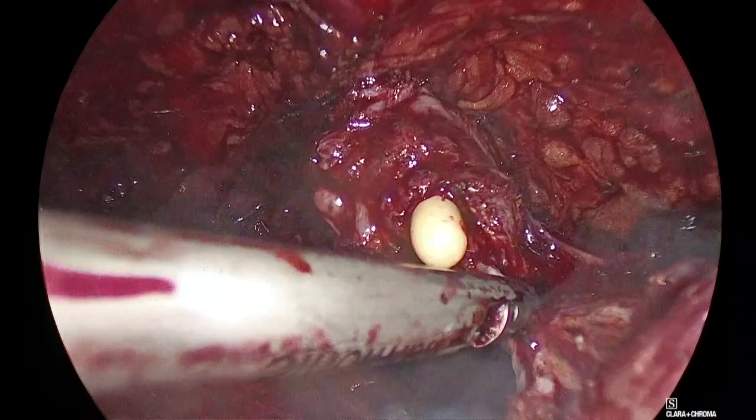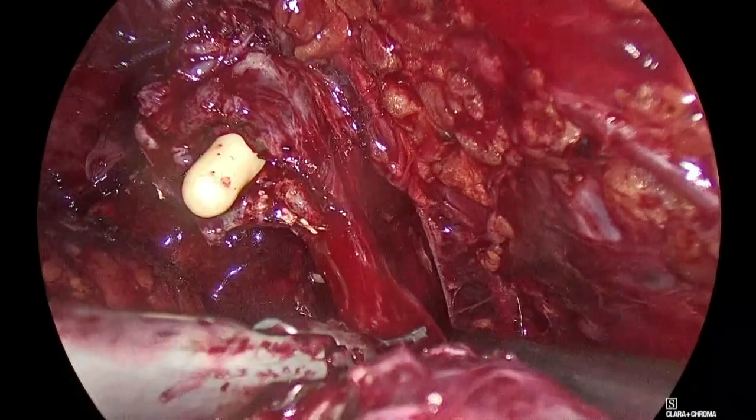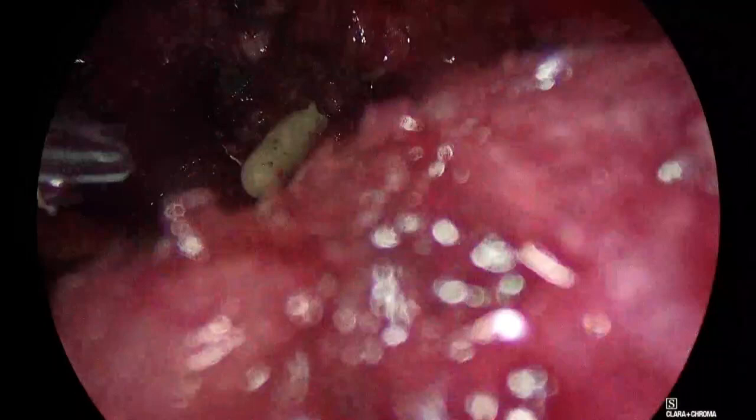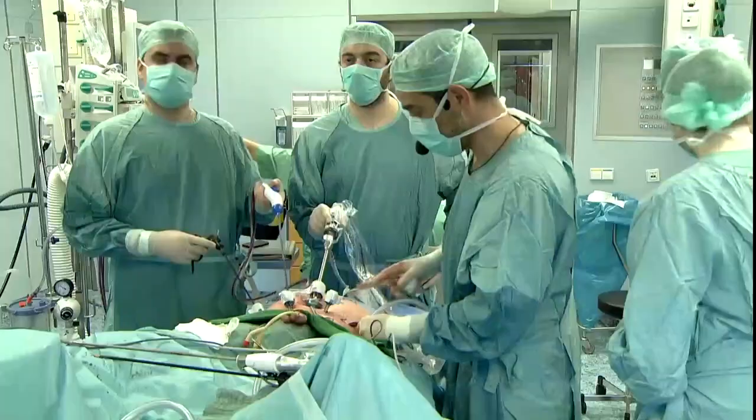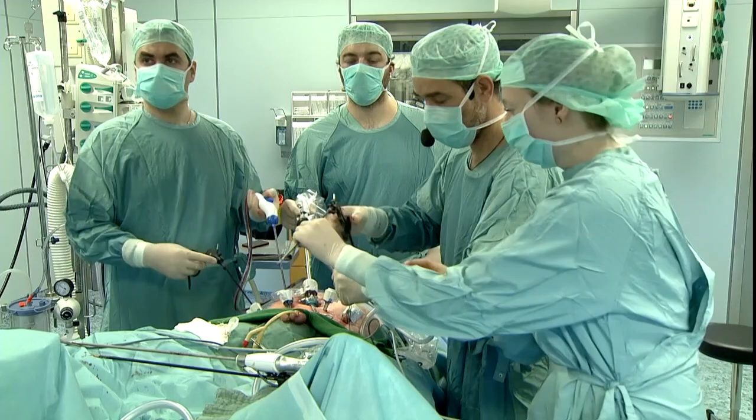Good. Show me on the right side. Good. Panagiotti, protect the other structures. Okay. Good. Be careful of your... Very good. Okay, take it to you. Bag. Good. I don't take the bag out. I leave it in and I pass parallel with my trocar. Check my trocar is in. Give me a strong grasper. Good. No. Here. To clamp here. Good. Thank you.